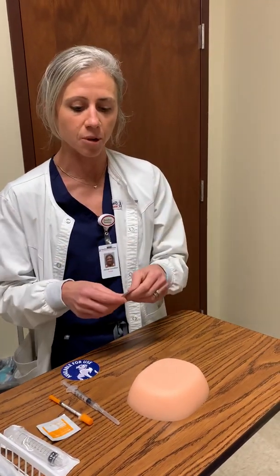So I'm going to have my alcohol. I've got my gloves. I'm going to make sure, as always, we're going to clean that site really, really good. Okay, so I'm going to open my alcohol. I'm going to clean that site really, really good. Okay, make sure you're putting some pressure in, and then with all alcohol, let it sit for a second. Okay, all right. Have your stuff prepared. Big thing that I tell you with needles. You need to be comfortable with them, okay?